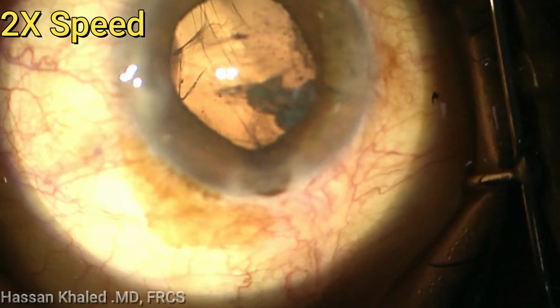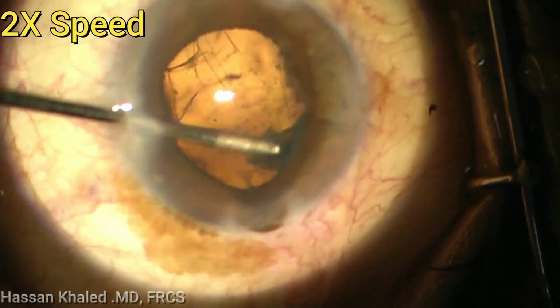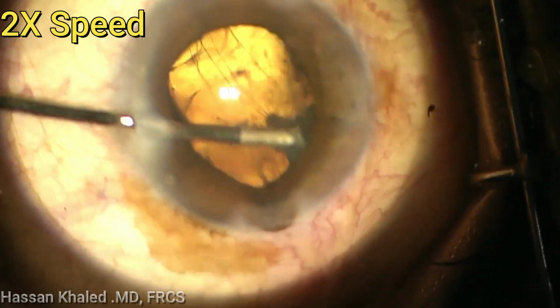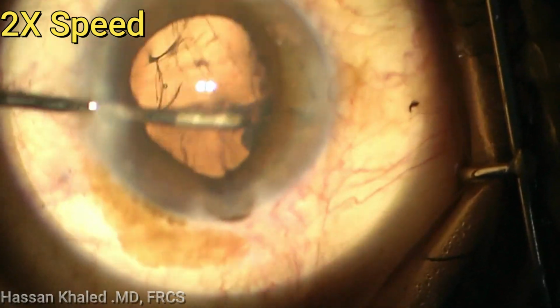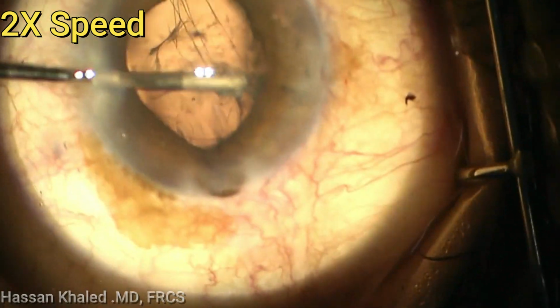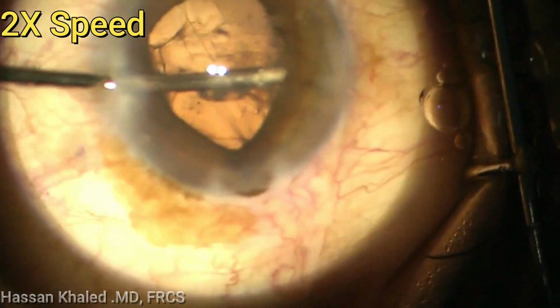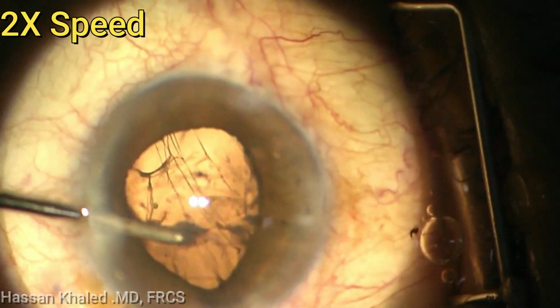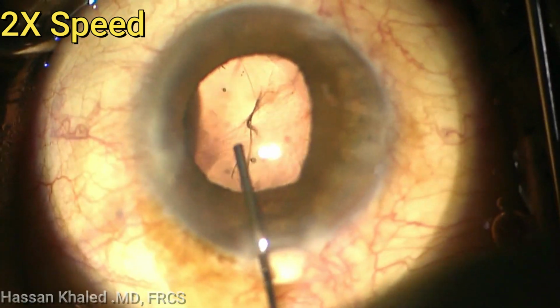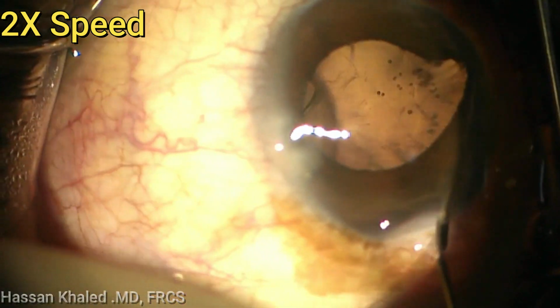You can see the cortex now, it's clear, and now using the large cannula connected to 5 cc to remove the cortex. Now you can see the cortex was removed almost completely. Now I'm injecting again the dispersive.